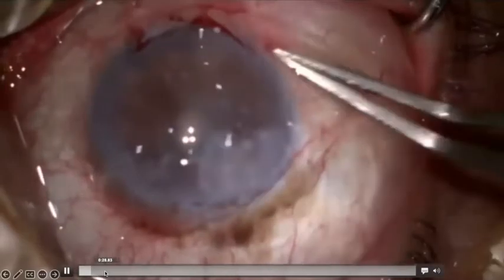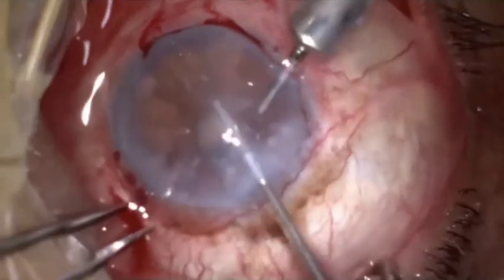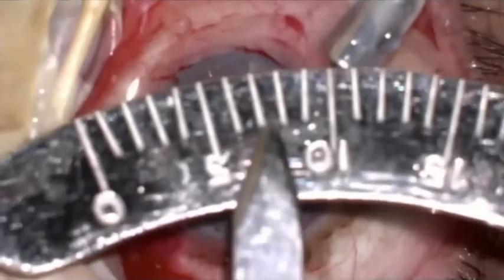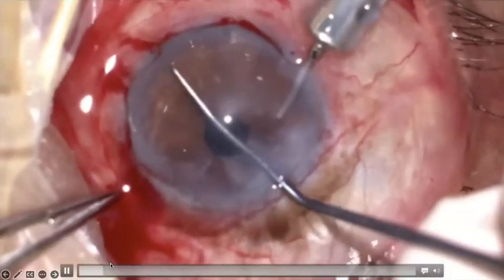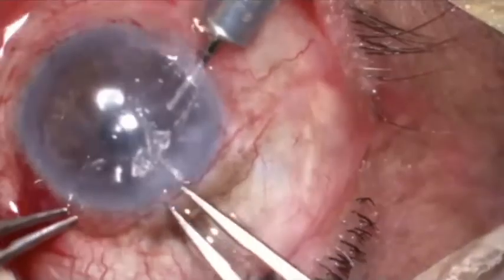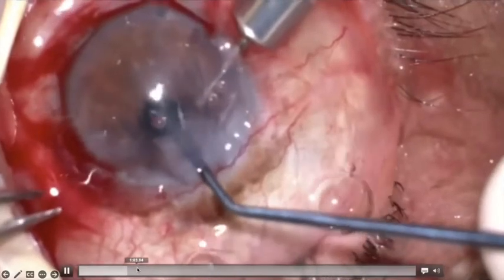This is a patient who had a peripheral iridectomy being done. Now in this case, I'm using just saline. I'm measuring the diameter of the graft that I need to put in. And generally, sometimes I just use the trephine. I create the big bubble and then use the trephine to match the diameter that I desire. Trephine to punch the PDEK graft. And you can also always mark the PDEK graft.